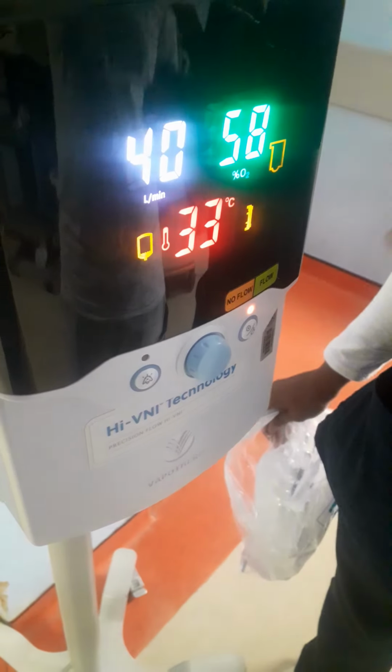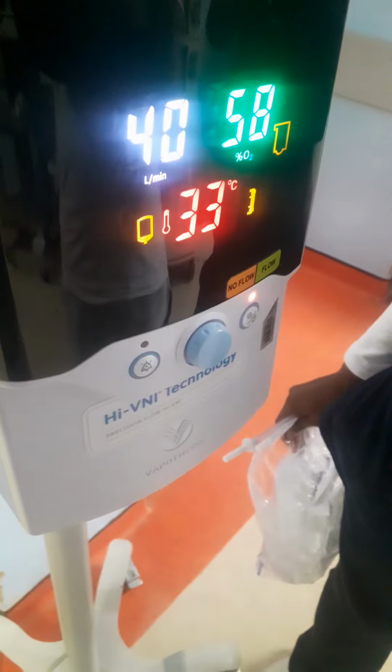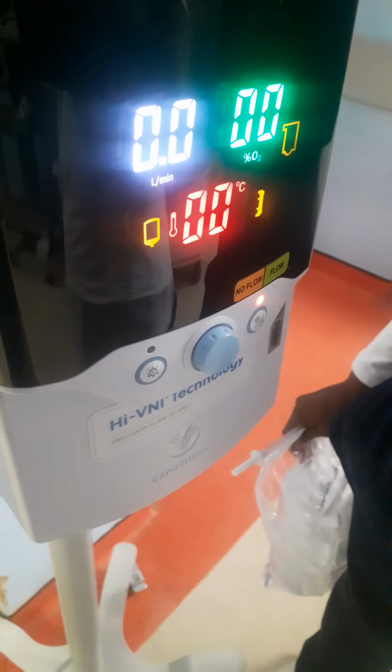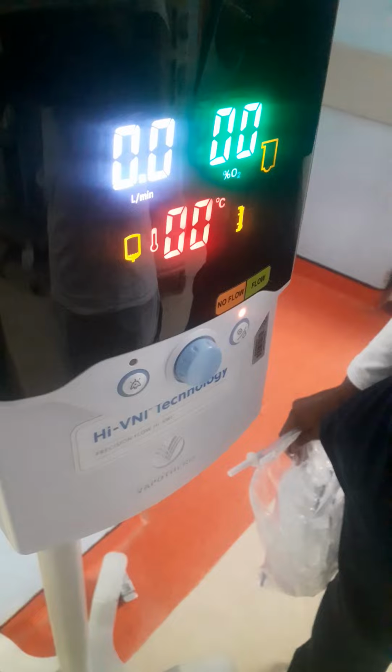So I start at low flow, and then I increase gradually as they are comfortable. Yes, monitoring my sats, and not just the numbers, also the patient. Look if the patient is coping.